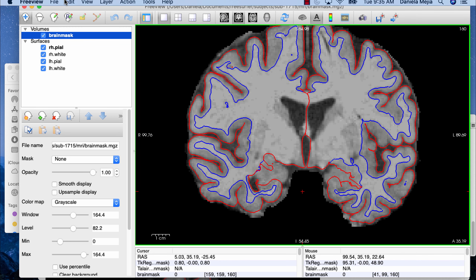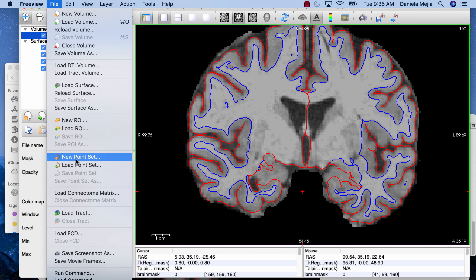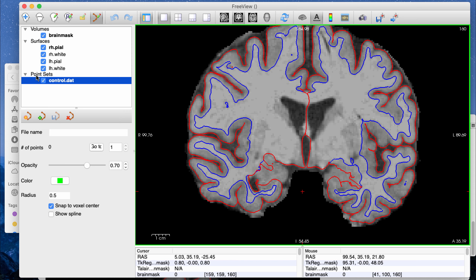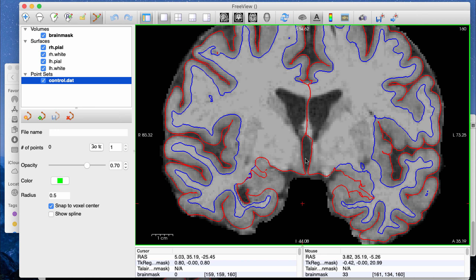Once you have this loaded, go to File > New Point Set. You want to create a text file that will store all the control points you add to your brain. It will ask you to enter a name — the tutorial says to name it control.dat, though the name doesn't really matter. Set the label to Control Points, which is the default, and this will always be selected as Brain Mask if loaded correctly. Click OK, and you'll have the new control.dat file. FreeView will automatically set the editor to Point Set Edit mode, meaning clicking will now add control points to your brain.